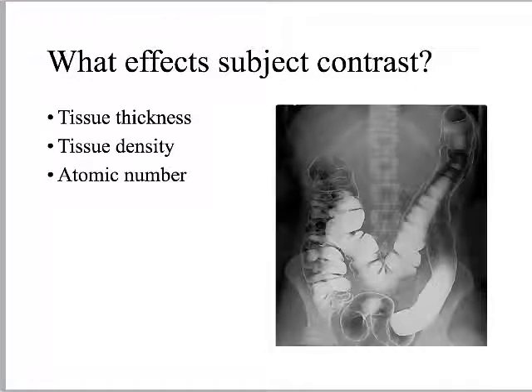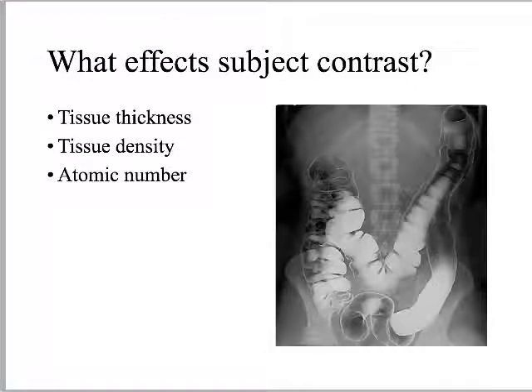We can see the distinction in contrast. Out where the tissue is less thick on the sides of the patient, I can clearly see the line of that portion of the descending colon. Versus over here — it's busy, and it's more difficult to say where does the bowel end and where does the spine begin. Why? It's thicker. The patient is just thicker there.